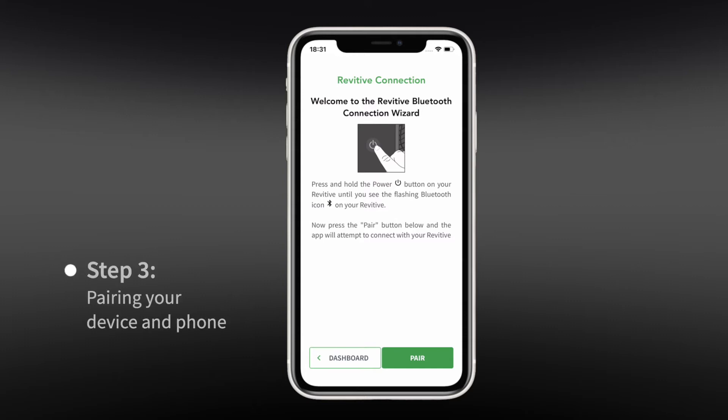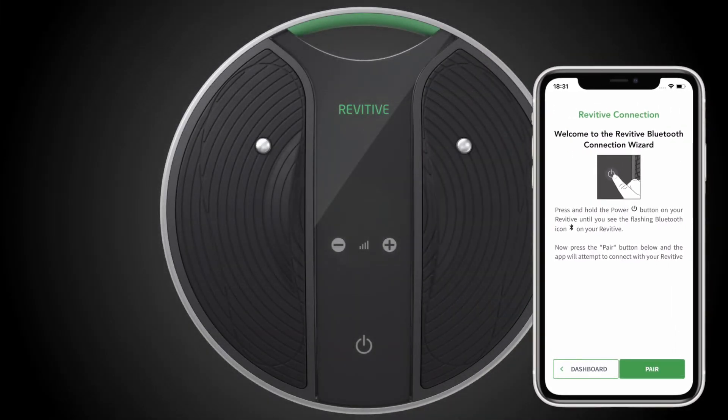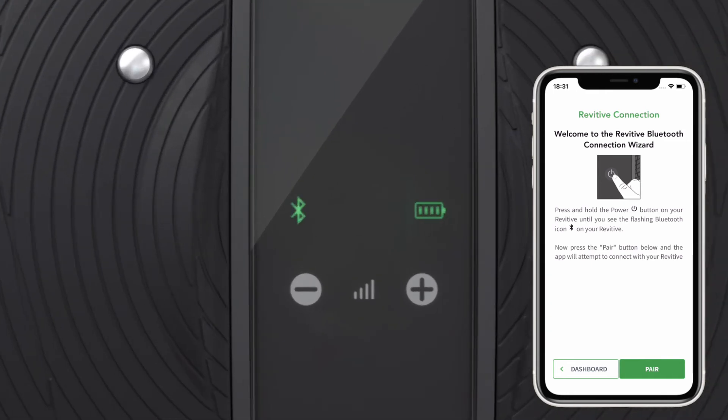The Bluetooth connection wizard screen will automatically appear in the app. Simply follow the on-screen instructions. You will be prompted to press and hold the power button on your Medic Coach until the Bluetooth icon appears and starts flashing. This puts your device in discovery mode. Next, press the pair button at the bottom of the app's connection wizard screen.